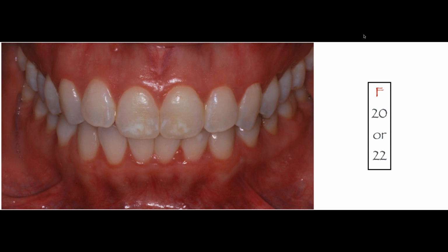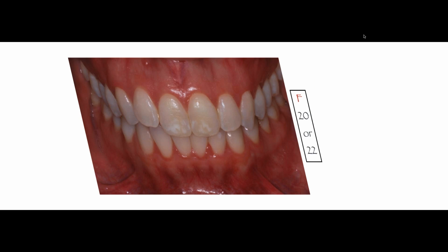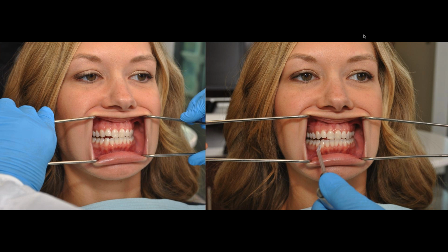Now, if I want to get a narrower shot, to see more detail in fewer teeth, then I need to get closer to the actual subject. So I'm going to take, for instance, a bleaching shot. This is a photo that we use for bleaching, just to show the patient the comparison between the maxillary and the mandibular arch before we start bleaching the maxillary arch.